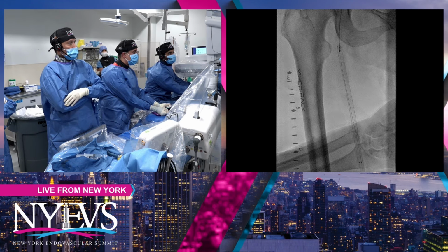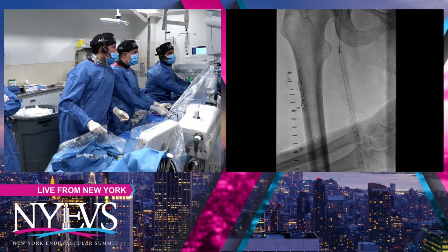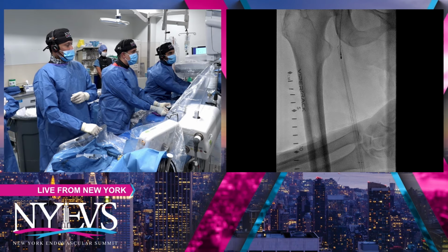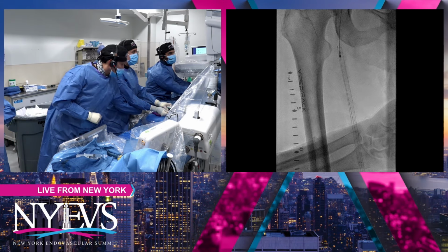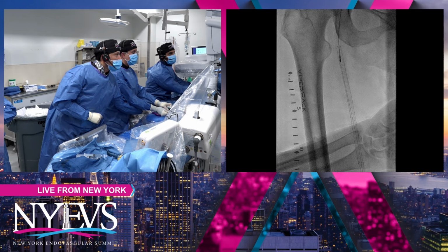Yeah, so we're going to give it one more shot to see if we did predilate. Hopefully, like you rightly said, this responds a little bit better. You can actually see how you... Vishal, it also may be Raman's forearm compressing the stent.